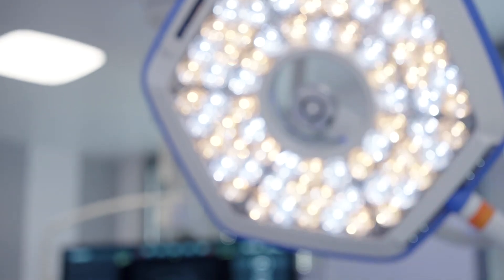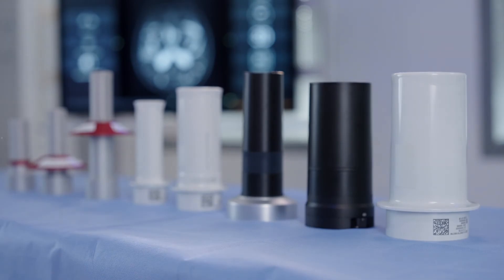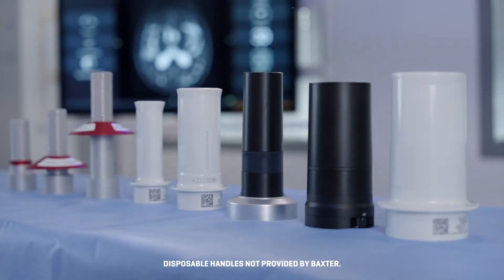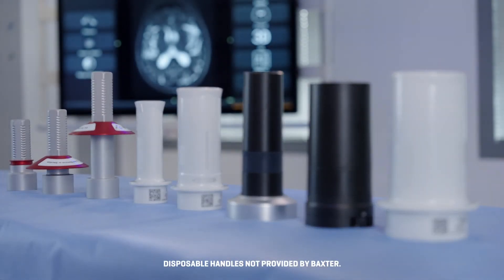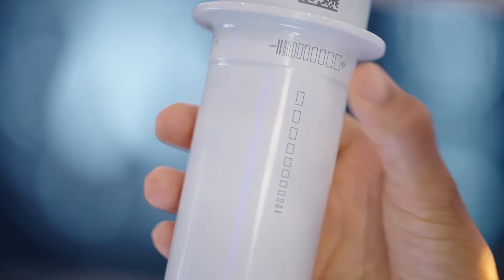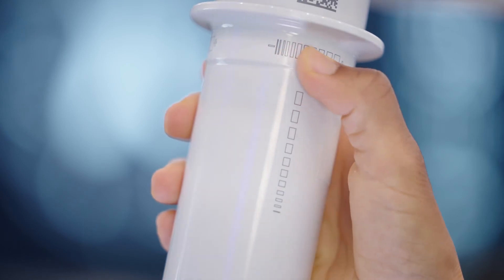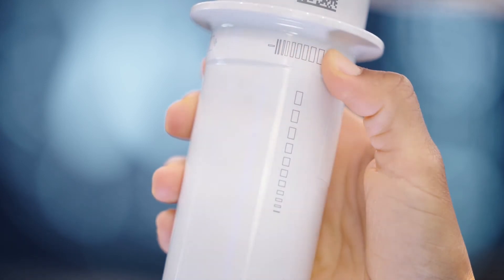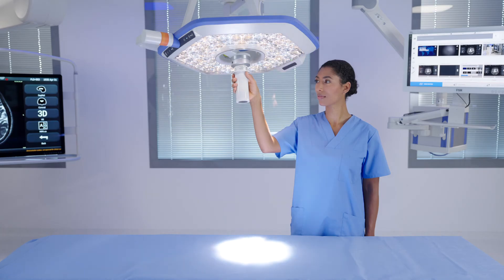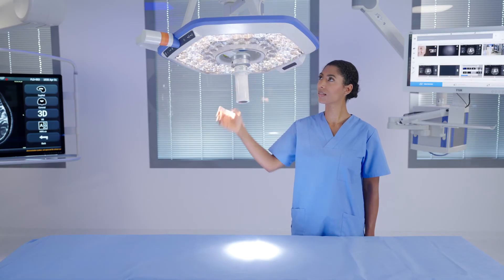The light head can be fitted with sterilizable standard, sterile light control, and camera handles, as well as sterile disposable handles by third-party providers. On the sterile light control or SLC handle, a horizontal slider can be used to sterile adjust a control of your choice. Options include brightness, color temperature, or illumination spot size, and can be set by your service team.